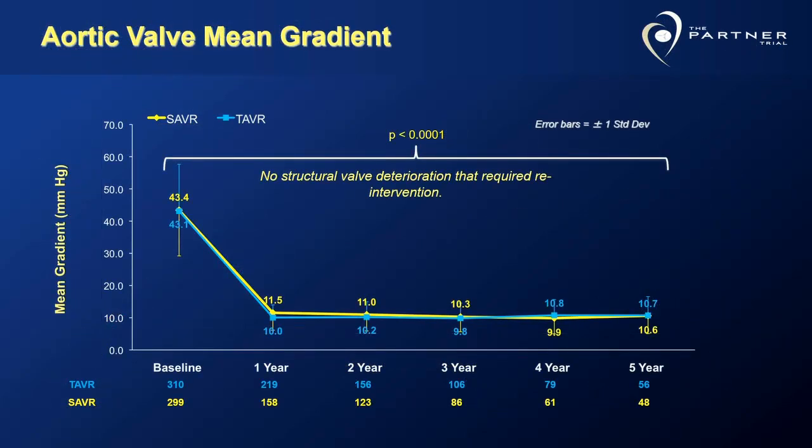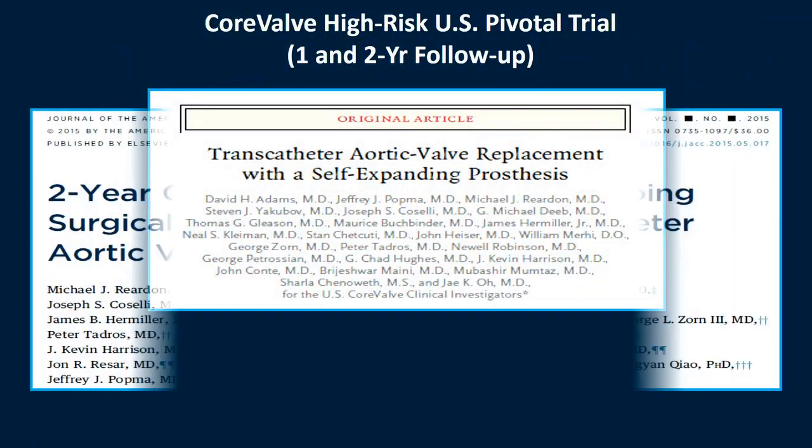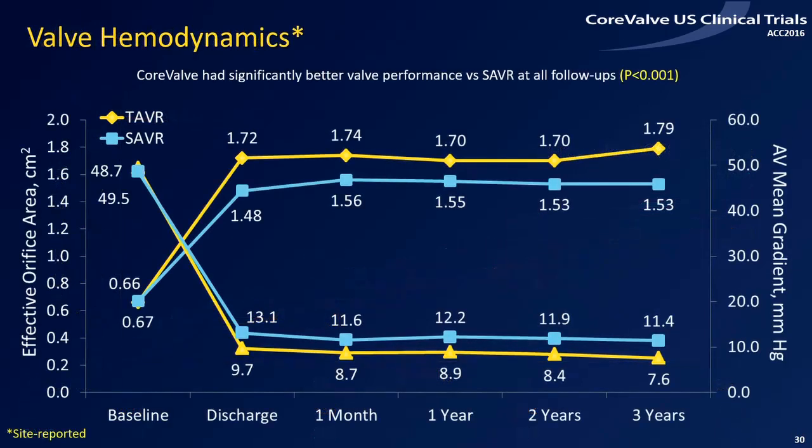And we're getting very good hemodynamics when we're looking at the aortic valve mean gradient and also the AVA after the procedure. CoreValve, which is the self-expanding valve, showed similar results for the high risk. Again, the 1 and 2 years follow-up did show that actually there is slight superiority, or a trend for superiority, when you compare it for the high-risk population versus the surgical approach. So that has become the default therapy. Now for every high risk and extreme risk, we are definitely going with TAVR, and even the surgeons are in agreement with that.